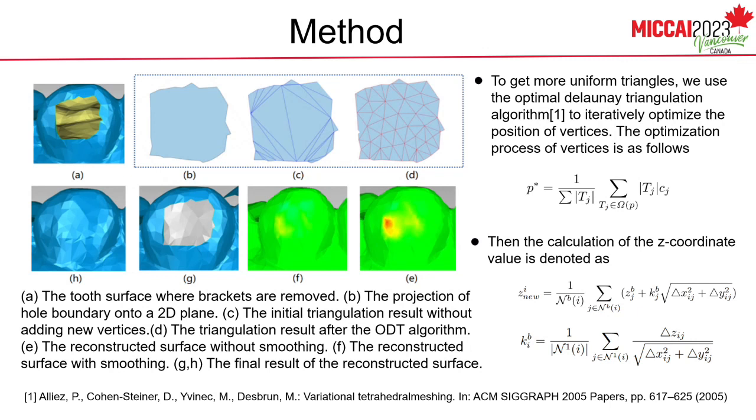After the polygon triangulation, the XY coordinates are determined and a layer-by-layer procedure is employed to estimate the corresponding z-values. To avoid the vertices at the gingiva, we only use the information of the first-ring neighborhoods of the boundary vertices. Before transforming back to the original space, the extreme z-values are removed by median filtering. Then we use a rotation matrix to obtain the coordinates in the original space.